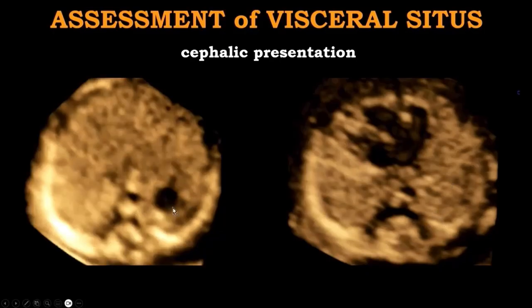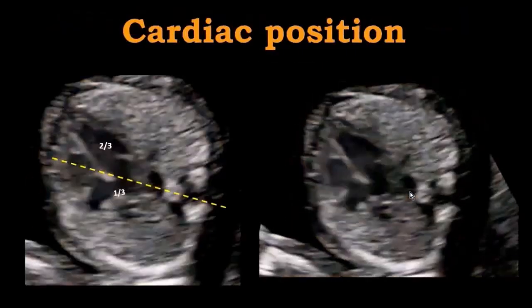Again, here we have a few things. We looked at the position of the stomach, we looked at the main vascular structures, which is sometimes not that easy to do. But what's really important to note at any gestational age is the position of the descending thoracic aorta, and when it's on the right, we can suspect right away aortic arch abnormalities. So this is how just two simple pictures can be interpreted, giving us a lot of clues for the anatomy of the heart.